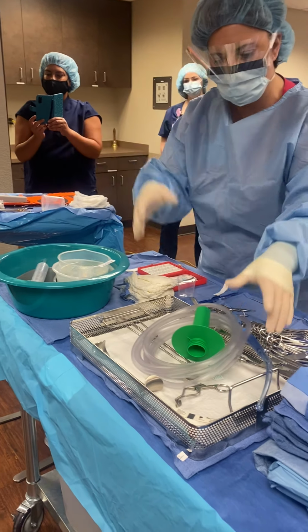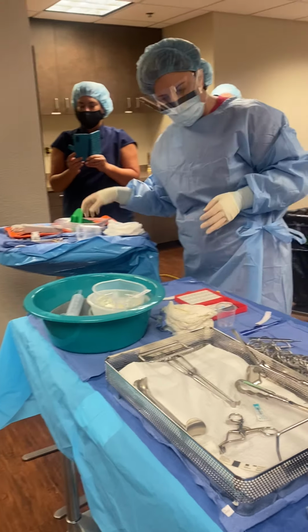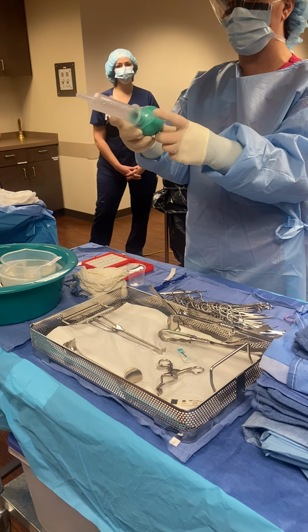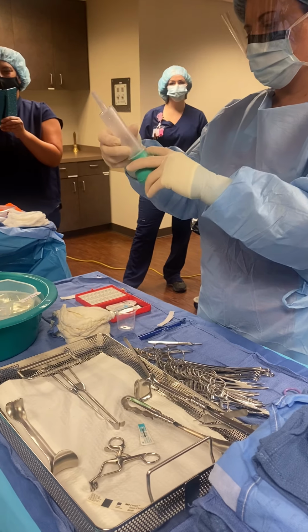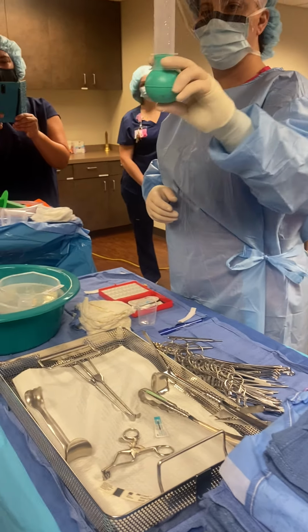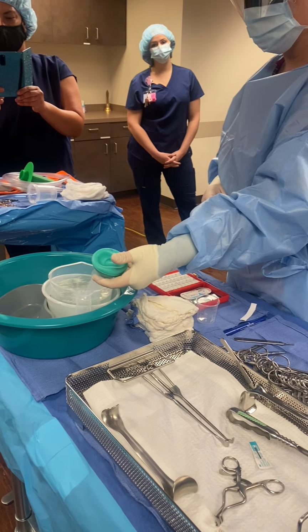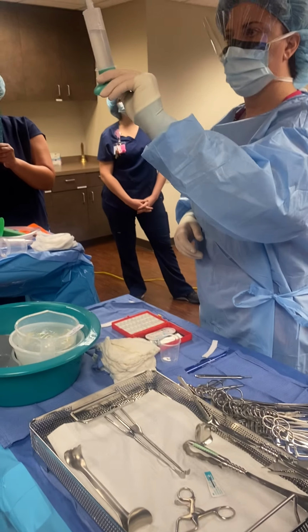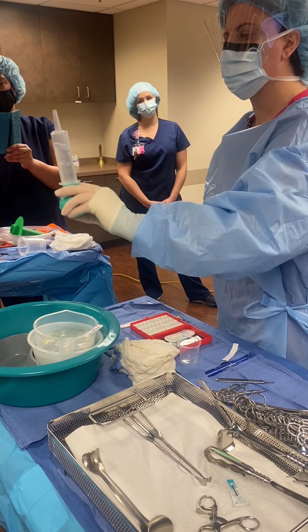I got my Bovie. Got my stuff that I'm going to put up right at the beginning of my case. Fill the aseptic. See these two little flanges right here? They say, put these two fingers there. That's what they say. If there was Braille, that's what they would say. The back of it has this little divot. Put your thumb there. This is the fastest way to fill it up. Push all the way up as hard as you can. Keep holding, put it in. Wait till it fills up. Turn it up to the sky. Do that again. And then one more time if you need to.